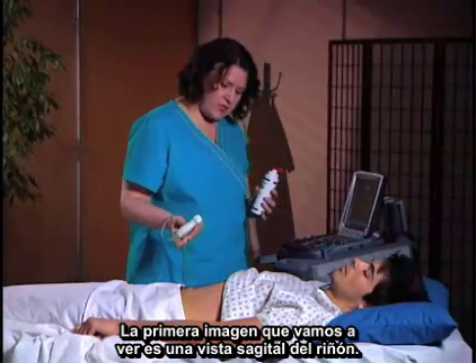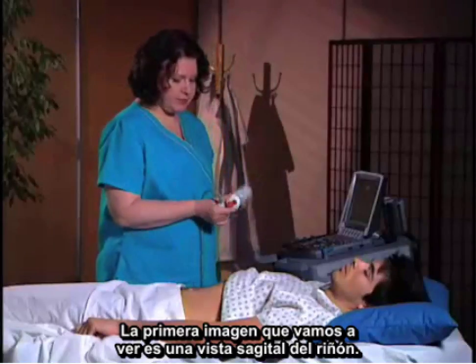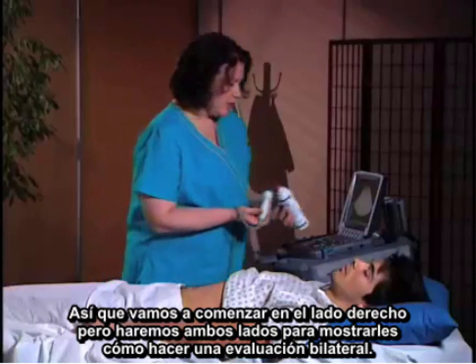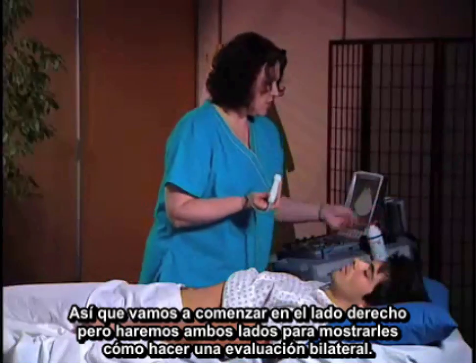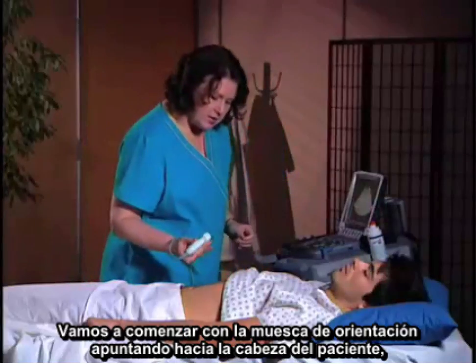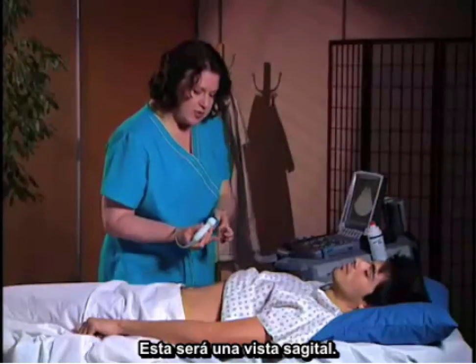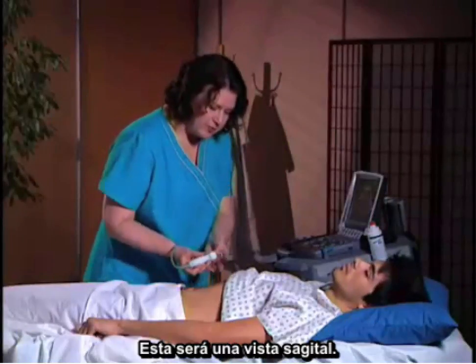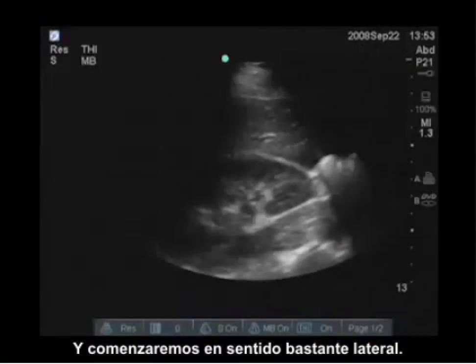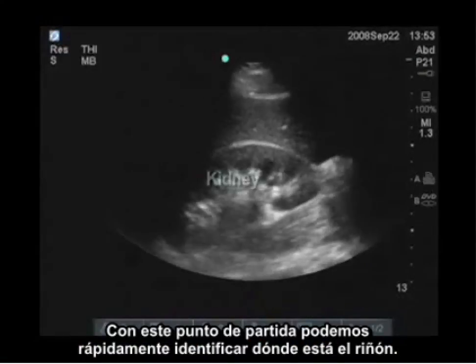The first view we're going to look at is a sagittal view of the kidney. I'm going to start on the right side, but I will do both sides. We'll go in with the orientation marker pointing to the patient's head for a sagittal view, going in fairly laterally. With this starting point, I can quickly identify where the kidney is.